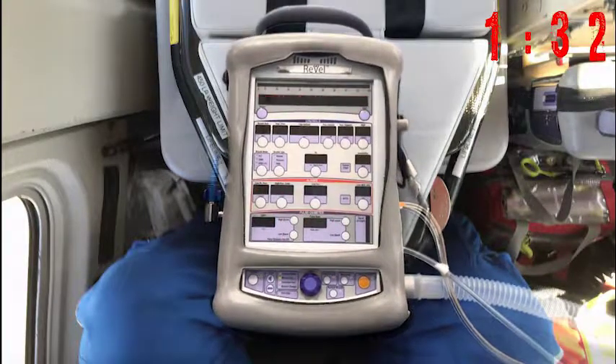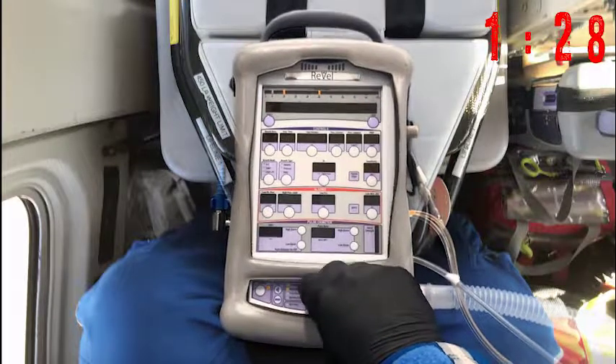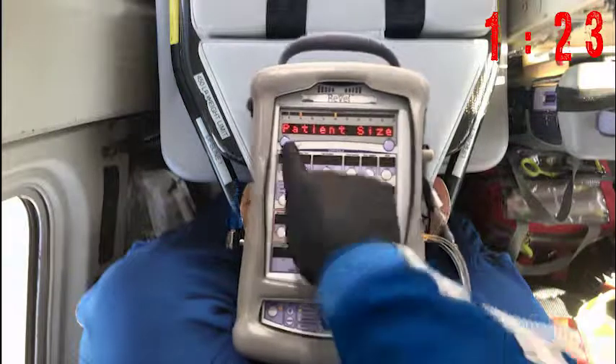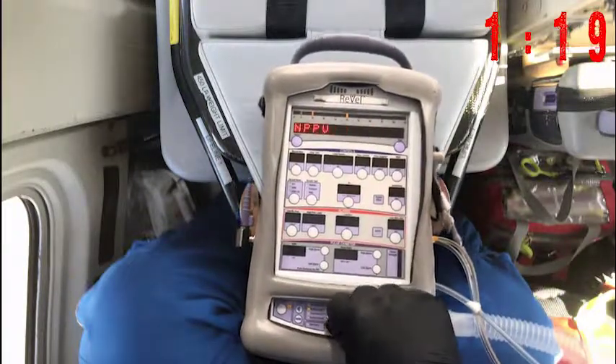Turn the Revell on. You may have to silence the alarm. Select New Patient, Adult, and NPPV.